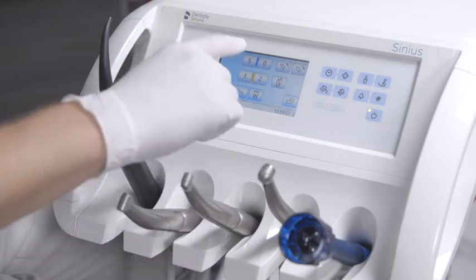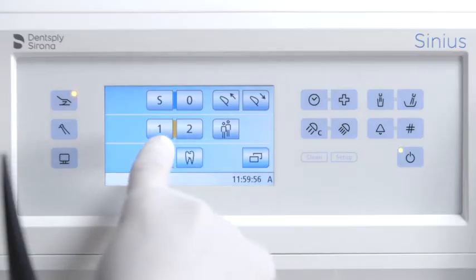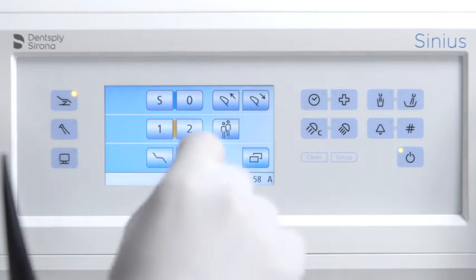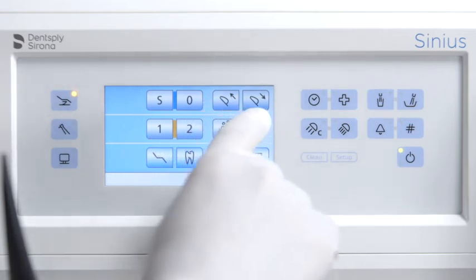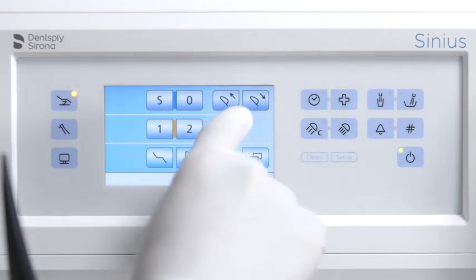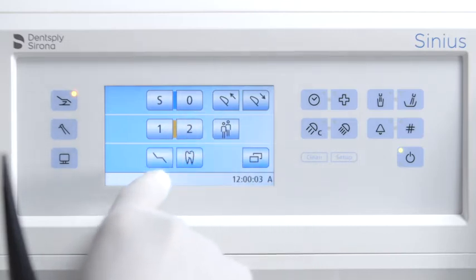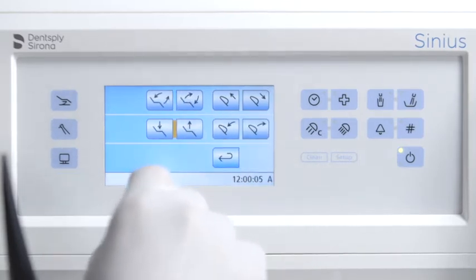The simple mode start program shows the function keys for the patient chair programs and allows you to move the headrest in and out. All other functions are listed in the separate manual chair setting screen.